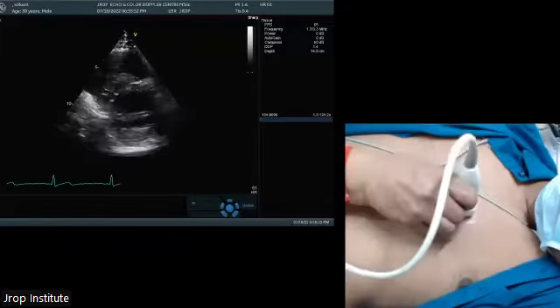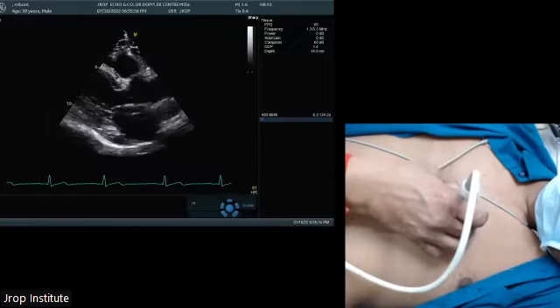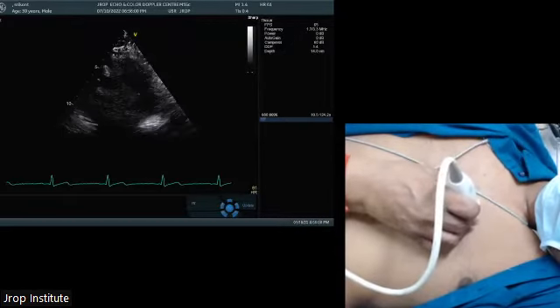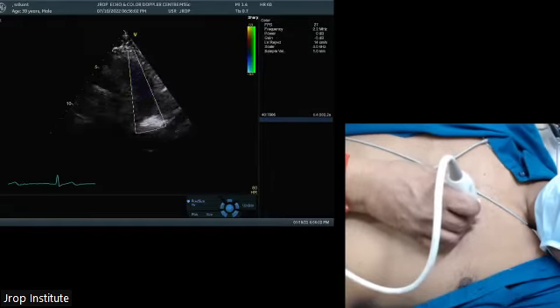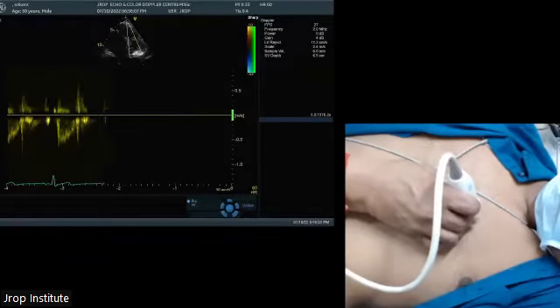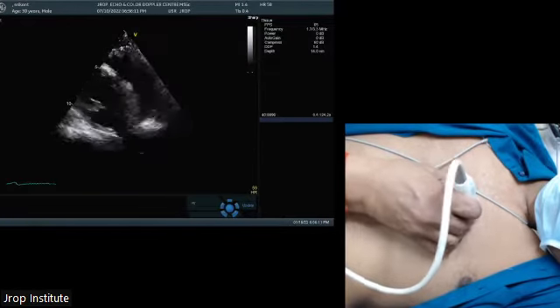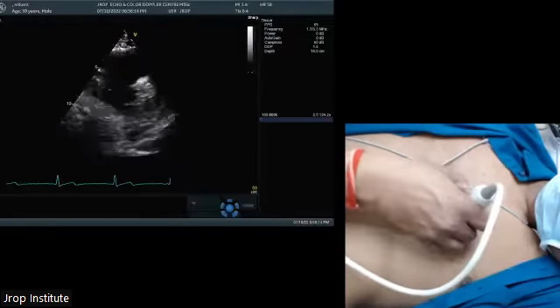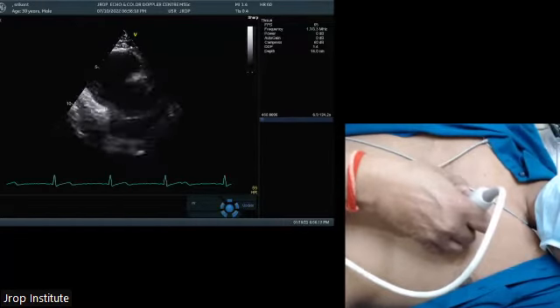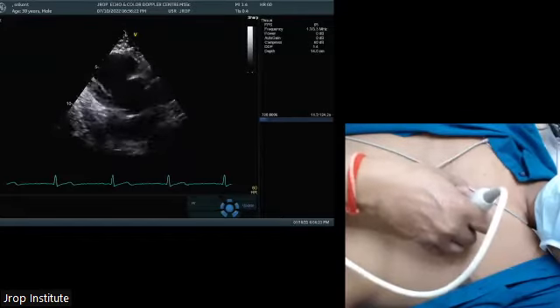And if I go to outflow tract, I said parasternal window, inflow view, and then outflow view. Here I'm going to look at again pulmonic artery. Same pulmonic artery in this outflow view. RA RV inflow, this is RV inflow view. Footprint looking towards mediastinum. Parasternal window, footprint looking towards mediastinum.